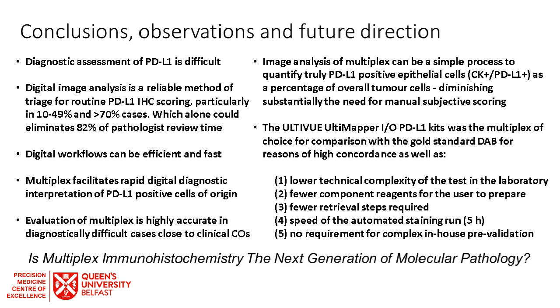So to conclude, multiplex IHC, the next generation of molecular pathology? I think it potentially is. But we'll have to wait and see what comes from clinical trials that are currently underway that are assessing multiplex IHC in these critical questions. But I think multiplex is definitely on the horizon for molecular pathology and molecular diagnostics.